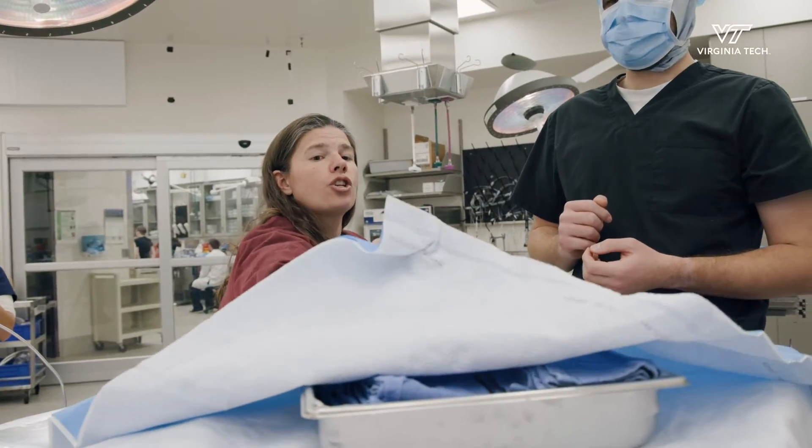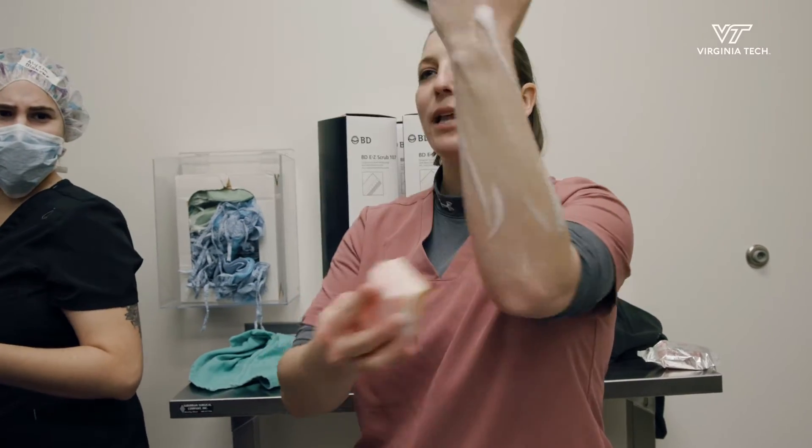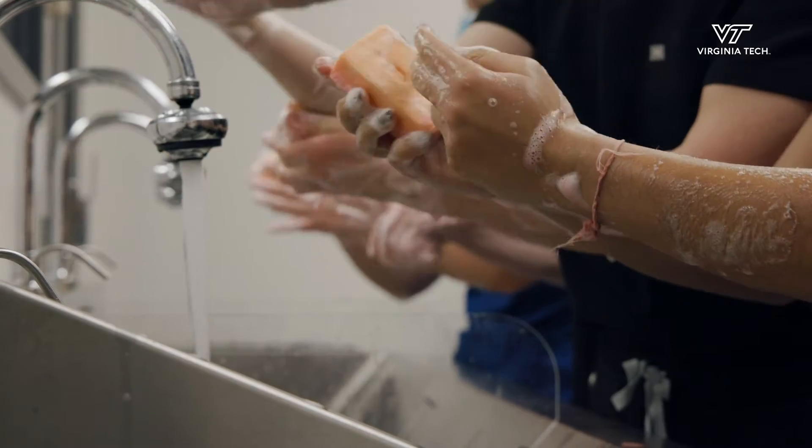Closer to the edge. Starting with your fingertips, you're going to work down and do one complete lather. That starts your five-minute contact time. You do that on both hands.